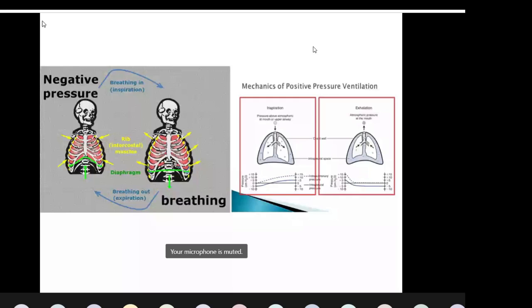Now why do you want to choose a ventilator for ARDS? Because Vineeth has rightly pointed out, compared to a standby NIV, the machine NIV or the invasive mechanical ventilator has got a higher percentage of FiO2 delivery, which is one of the parameters that can be used to improve the oxygenation.